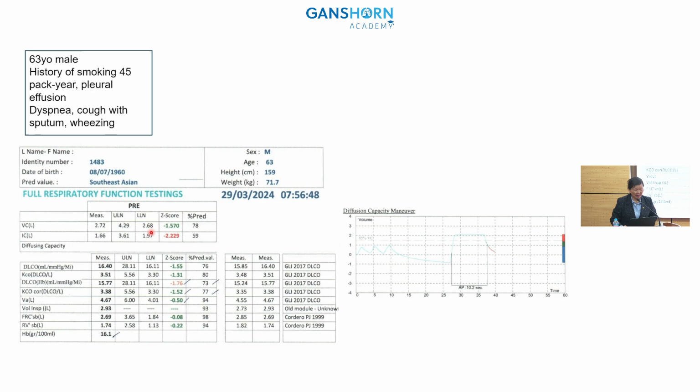And how about the DLCO? DLCO with hemoglobin is here. We have a low DLCO. How about the KCO?